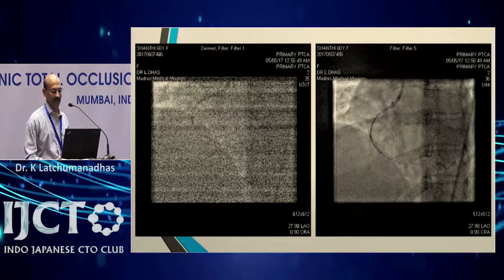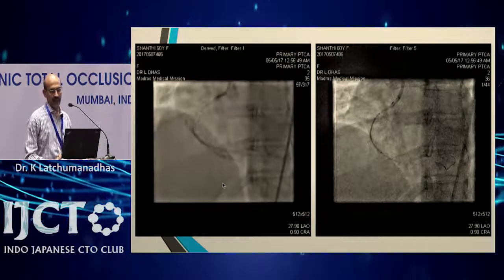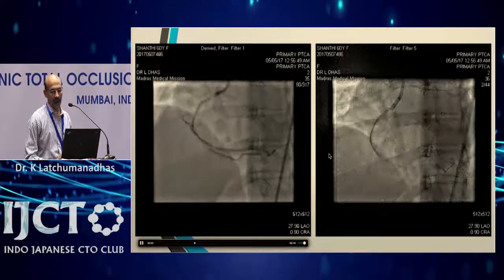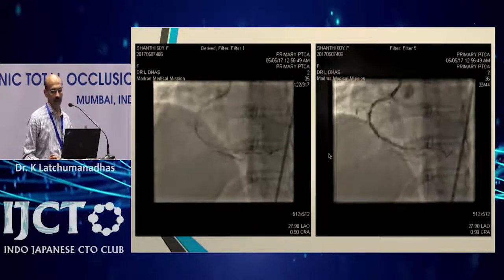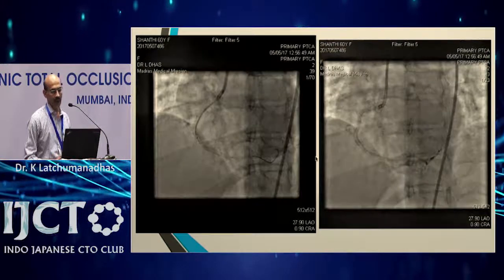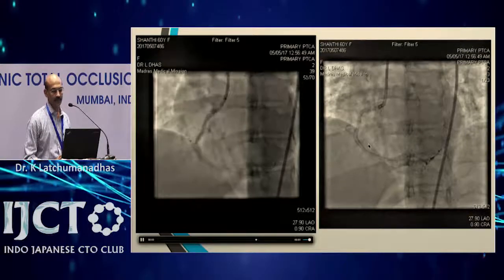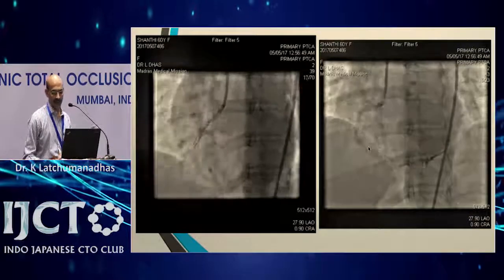So I have used two anchoring techniques to take that GuideLiner deeply, and then I delivered the stent. So one after another, I delivered the distal stent, and I have brought the proximal stent also again with the help of the GuideLiner. And this is the final result.